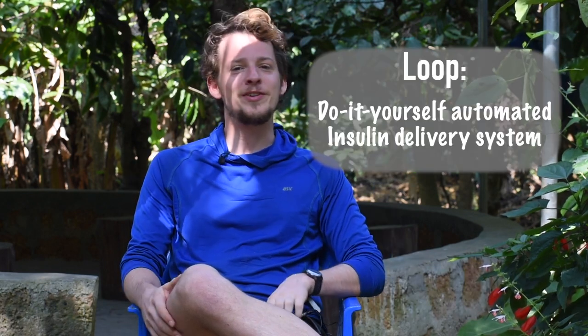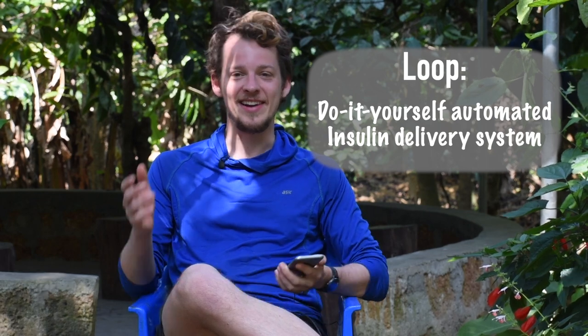If you haven't heard about Loop, I will leave my video from maybe 2018 up here that explains it all. But it is the do-it-yourself artificial pancreas that connects your insulin pump to your smartphone using a device called a Riley Link. Put simply, you bolus and do everything through your smartphone and it automatically sends it to your insulin pump.